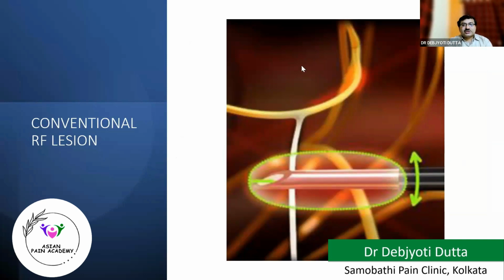So that is the lesion around the conventional radio frequency probe. So actually, there is a zone around the needle. What happens in conventional radio frequency? Say around the needle, this area is first heated, and this area is heated maximally. Say it is heated at around 80 degrees Celsius, as the tip is kept at 80 degrees Celsius. Then a little away from it, it is slightly reduced, and it is not in a stepwise manner, but continuous. So you can say it is at 60 degrees. Further, a little away from it, the heat is slightly less. So it will remain at say 50 degrees Celsius.